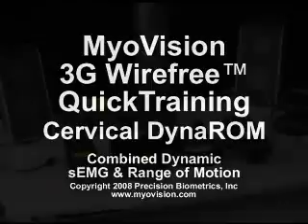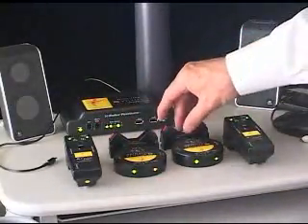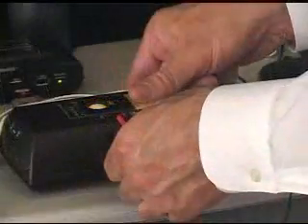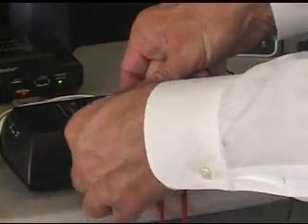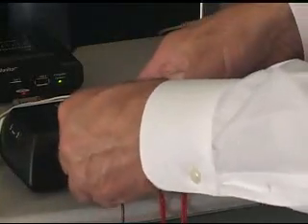I'm the inventor of the MyoVision 3G system. I'm going to show you how to use it today for doing the cervical DynaROM testing. This is showing that you can see connection to the device by using the green lights. You want to make sure to not turn on the device until the software prompts you to, though.